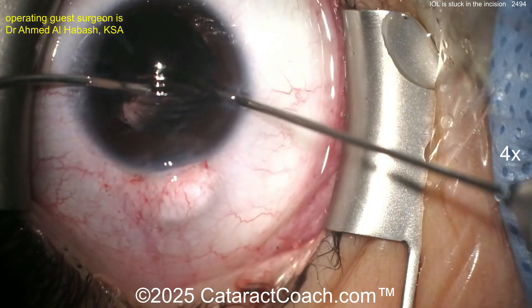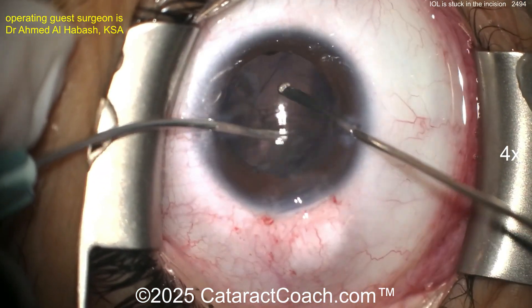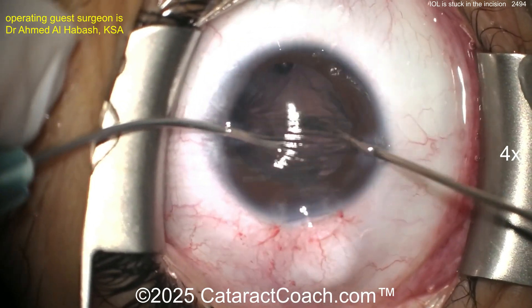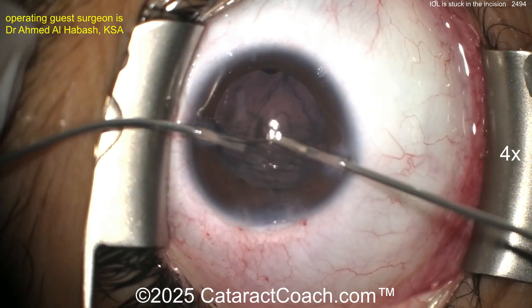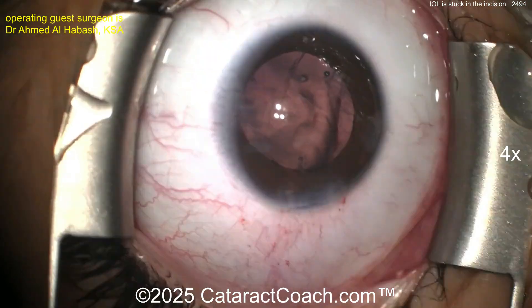The issue here was the incision was too tight. It's okay to use the wound-assist technique when you're positioning the IOL, but once you start to get the lens in the eye you really want to bring the eye back to primary position. If you're sitting temporally and pushing the eye so far into the nasal canthus that you can't see the cornea anymore, that's probably not a great move.